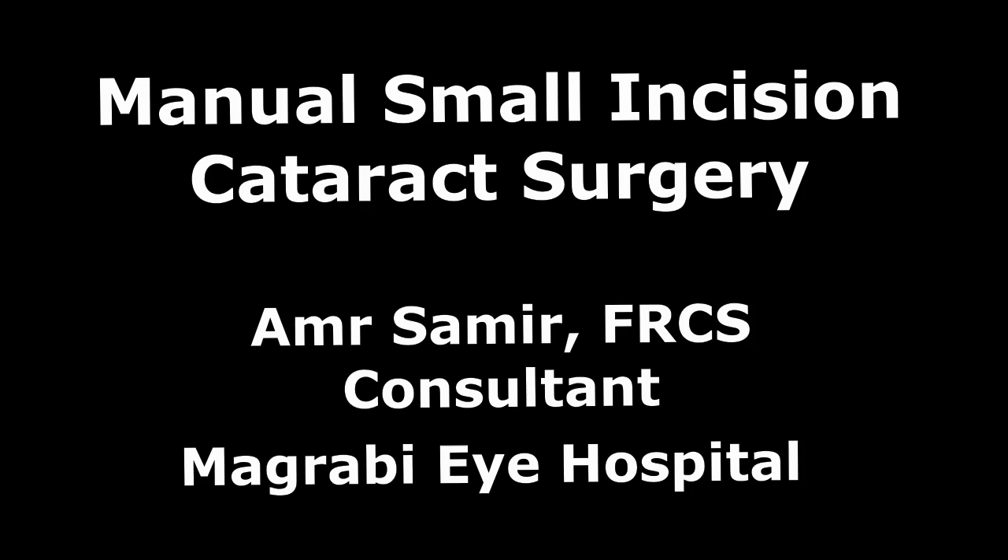Hello everyone, today I'm going to show you the manual small incision cataract surgery. There are many different techniques and ways for doing this type of surgery. Today I'm going to show you what I believe is an easy, simple technique that does not require any special instruments, and I'm going to tell you my tips and tricks for each and every step.